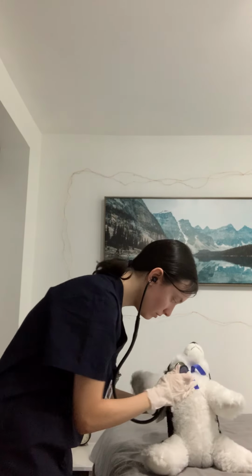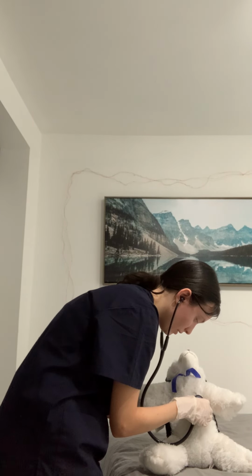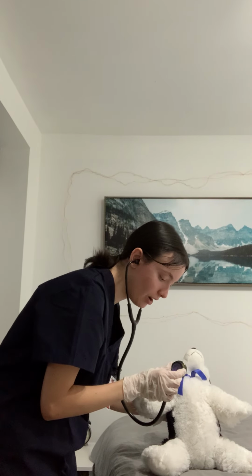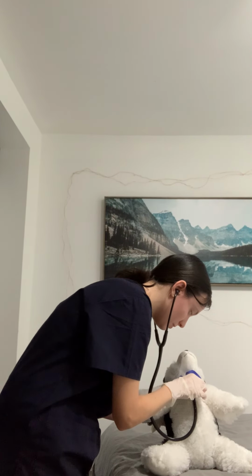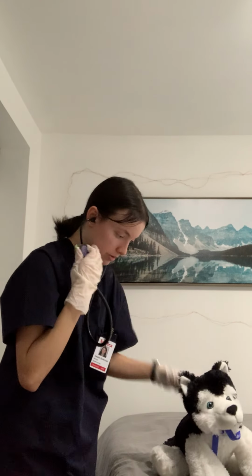So S1 sounds are best heard at the apex of the heart near the tricuspid valve and the mitral valve. And I'm now going to assess for S2 sounds, which are best heard at the base of the heart, near the aortic and pulmonic valve. All right, so S1 and S2 sounds were heard. Now I'm going to go and assess the abdomen.